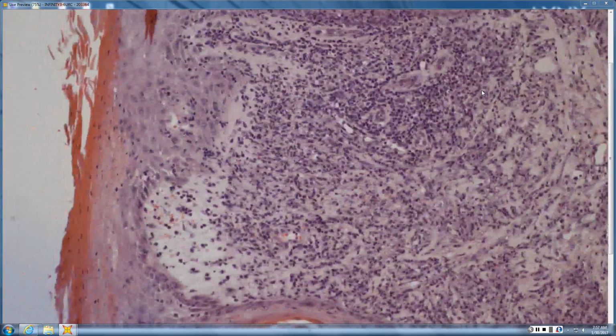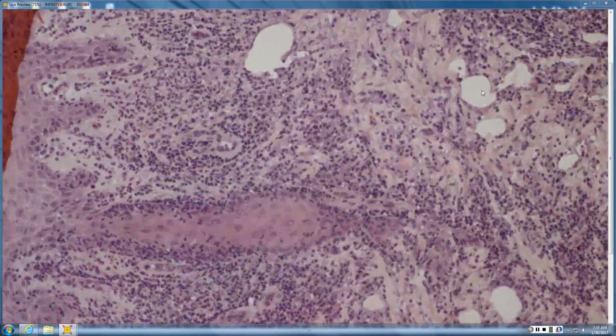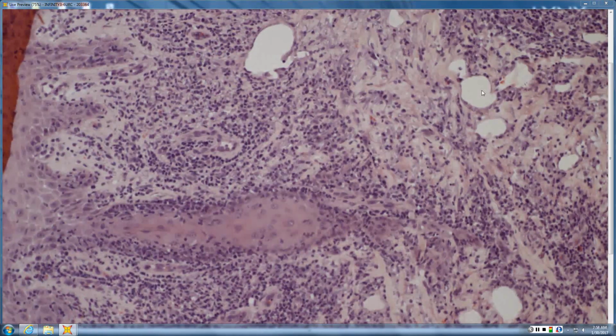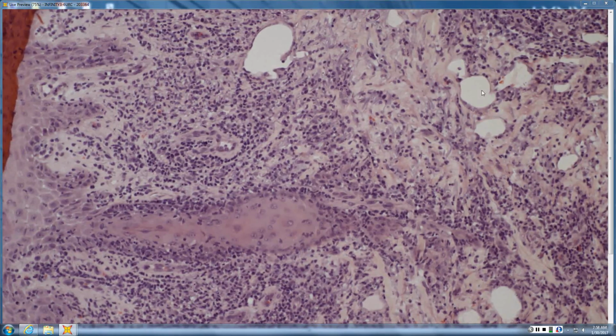When you look histologically, there's a little bit of interface dermatitis. There's elongation of the rete. I might get a spirochete stain too, because you definitely see co-infections. If this is an HIV patient from an area where leish is endemic, there are definitely cases of co-infection of leish and syphilis that you see. So it'd probably be worth a spirochete stain as well. We don't know the history on that particular one.